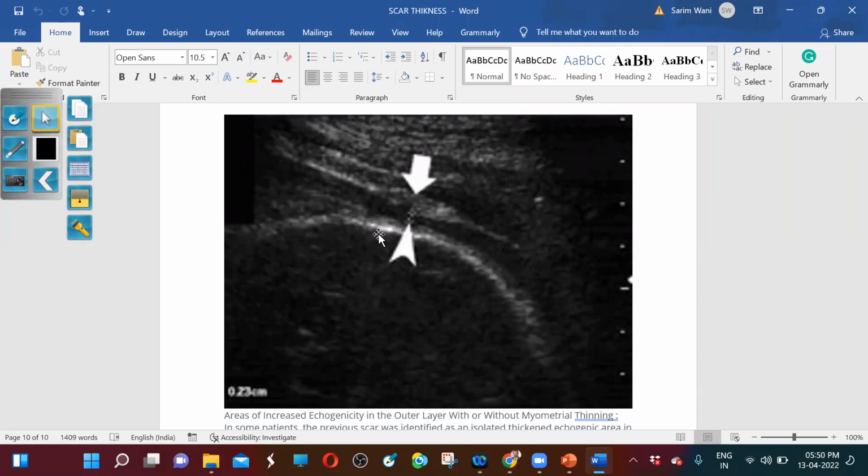That is why sometimes a report comes to you that the scar thickness is 4 mm or maybe 5 millimeters, and you are not taking a chance of normal delivery, you are going for a cesarean section, and when you take the section, you are even seeing the hair of the fetus through that small thin scar, and you say to yourself, thank God, hey Bhagwan, aaj kar diya, kal to ye burst ho jata.